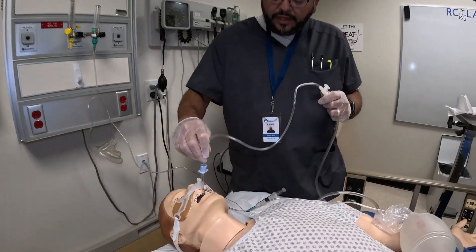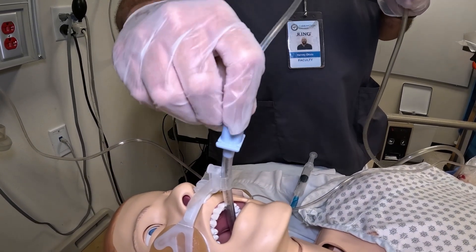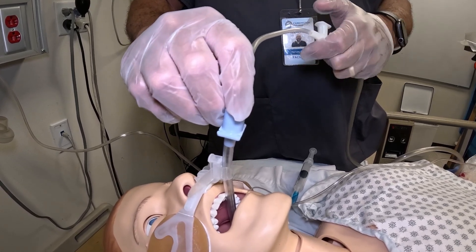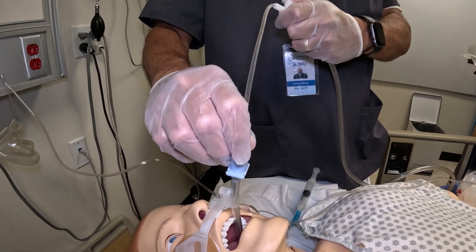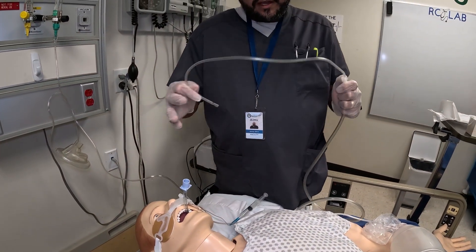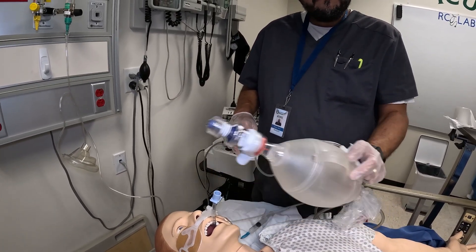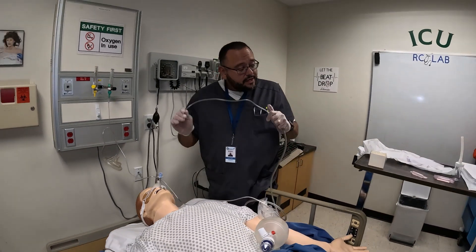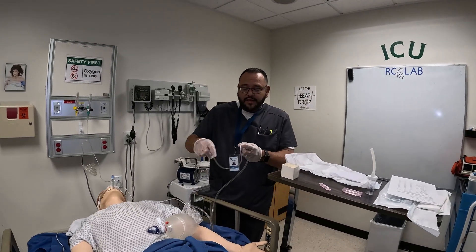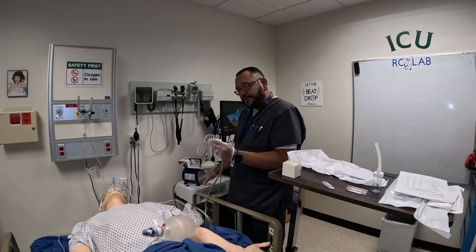I'm going to go ahead and unwrap this, then insert the catheter into the tube. This tube is a bit small so the catheter doesn't go down as easily, but I'll show you: I go down until I meet a gag reflex or I meet resistance, then you start suctioning on the way out. Once I start suctioning on the way out I pull back. Give the patient time to catch a breath; if I need to give more ventilation in between I would do that. You can clean the catheter by putting saline in the basin and suctioning it through.